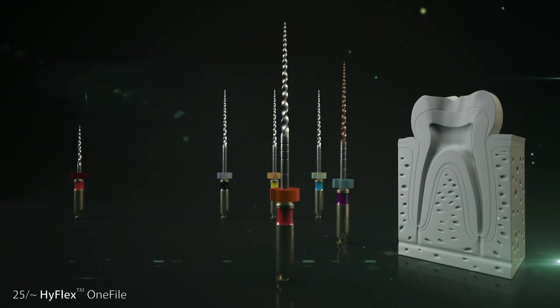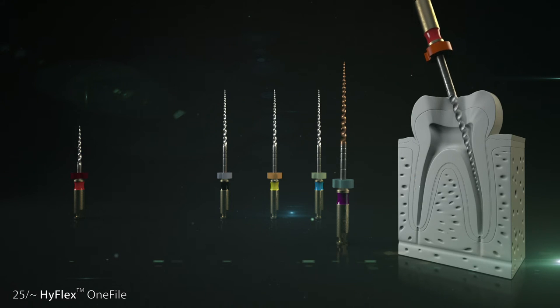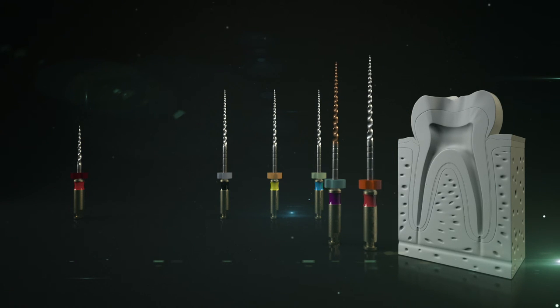Step 2. A HyFlex EDM1 file is used for the final preparation in the middle and apical areas of the root canal. Here again, the dentist uses the file up to its working length with cautious up and down touching movements. Regular rinsing during the treatment helps to remove the dentin and generally enhances the ability of the files to glide along the canal.